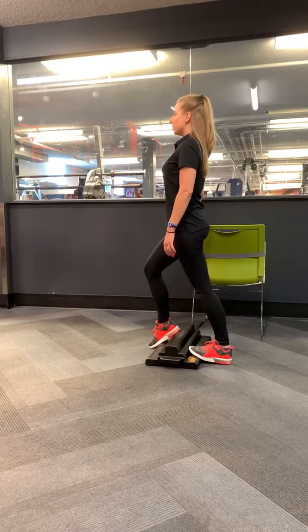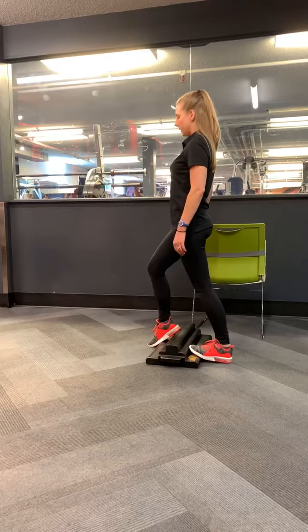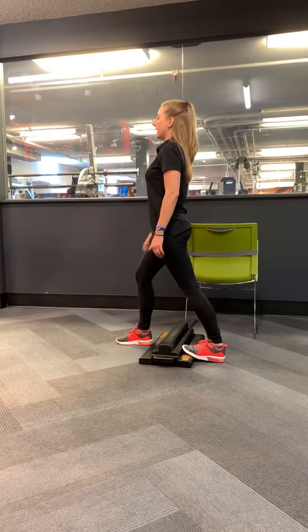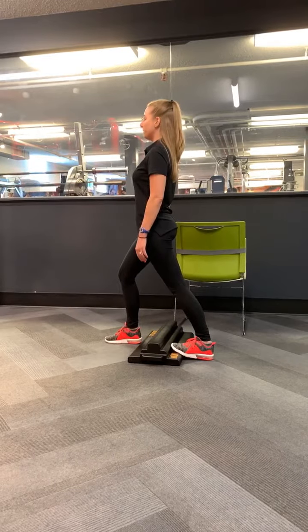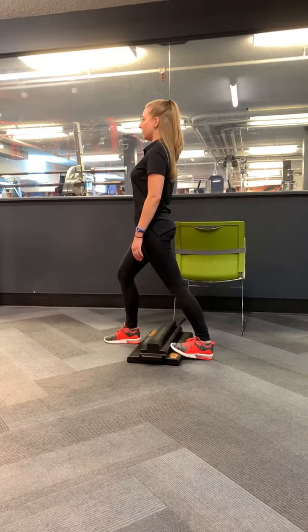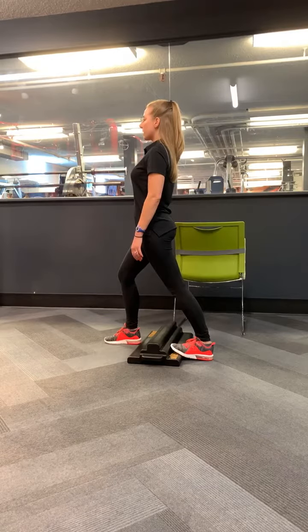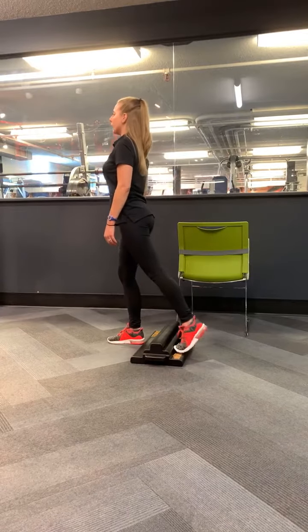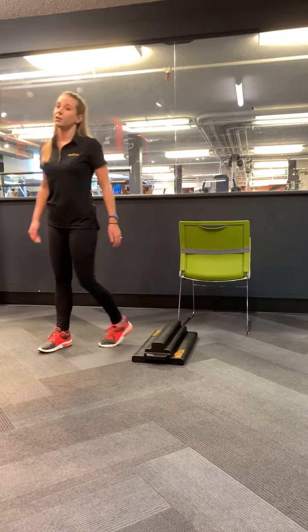And 3, 2, 1. And now we're going into pre-swing. Placing that foot all the way in front of the Moflex on the ground. Again, you can bend that knee if you need to help you shift your hips forward. And stand nice and tall. And bring that left foot all the way over top of the Moflex to match it next to your right foot. So that's your gait.